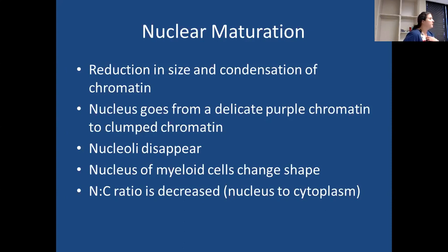And even me as a seasoned hematologist versus Angie, who works in hematology on a daily basis, there's some variety. There's some differences between what I call and what she calls. And so we accept that. We acknowledge that. The big thing is that it's immature. And you say, oh, I have granules, I have nucleoli, the nucleus is very fine, it's not condensed. All right, so you have to be able to back your answer up. And you guys will be pros at that in lab, because we'll talk about it again in lab too.